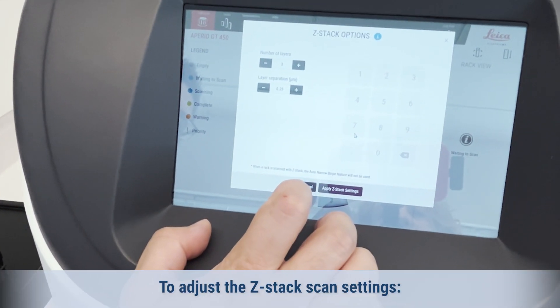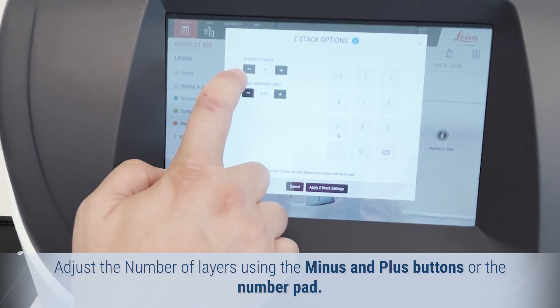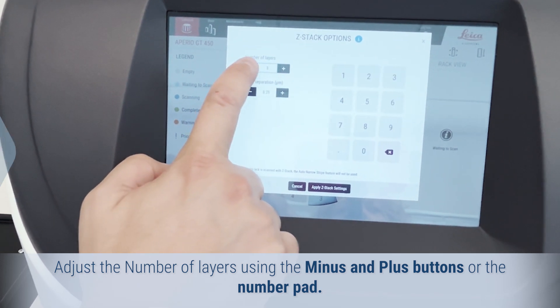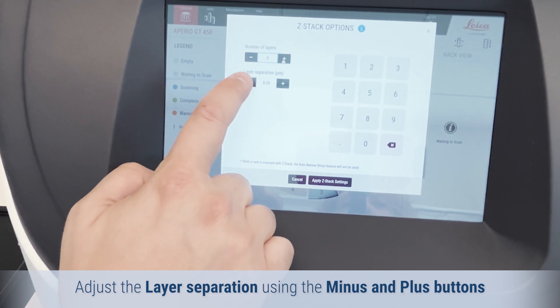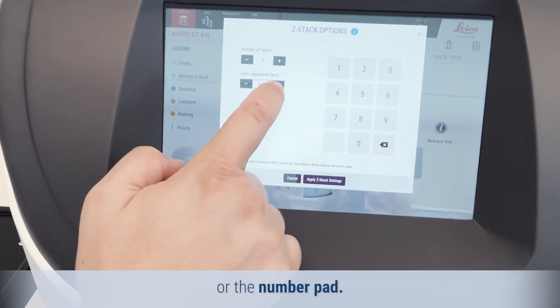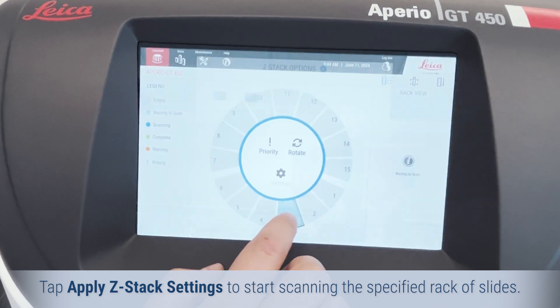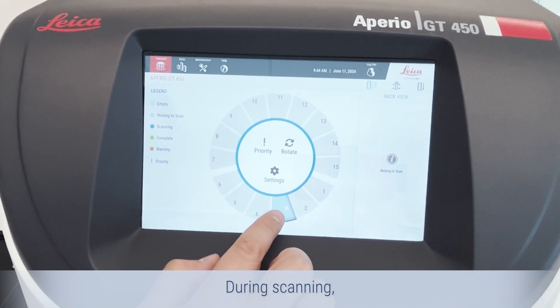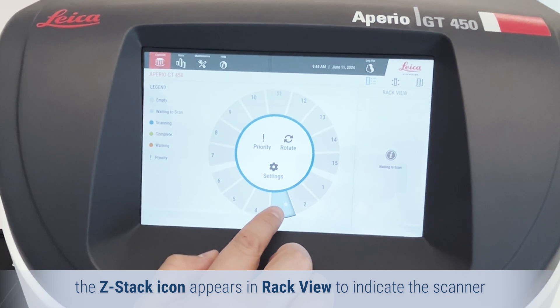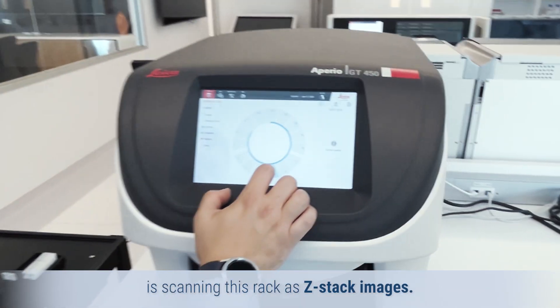To adjust the Z-Stack scan settings, adjust the number of layers using the minus and plus buttons or the number pad. Adjust the layer separation using the minus and plus buttons or the number pad. Tap Apply Z-Stack Settings to start scanning the specified rack of slides. During scanning, the Z-Stack icon appears in rack view to indicate the scanner is scanning this rack as Z-Stack images.